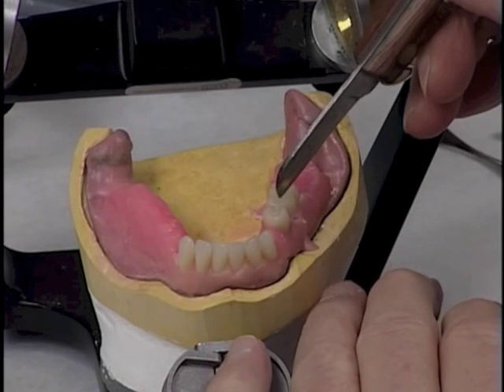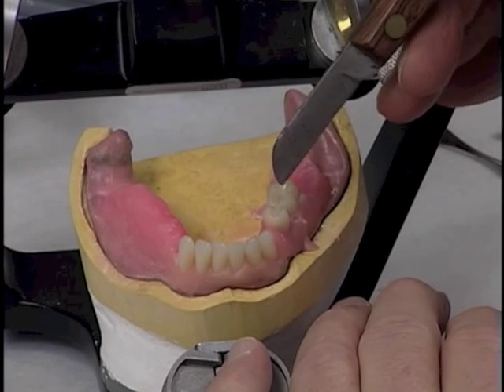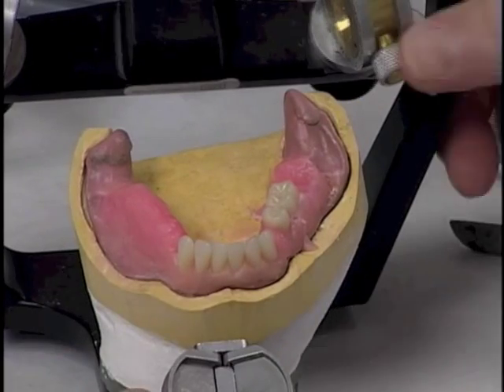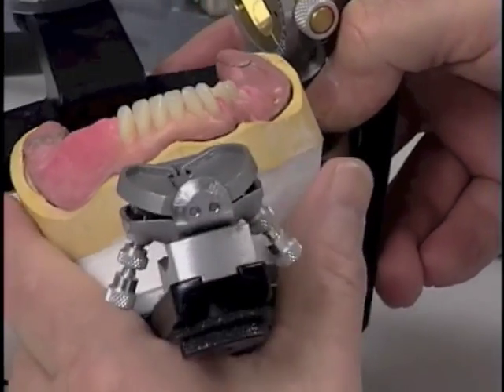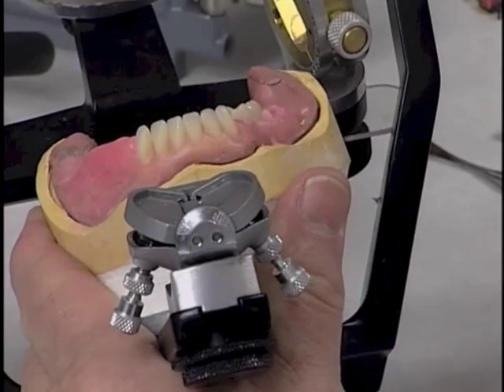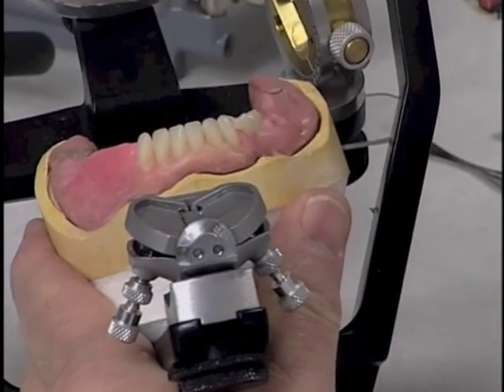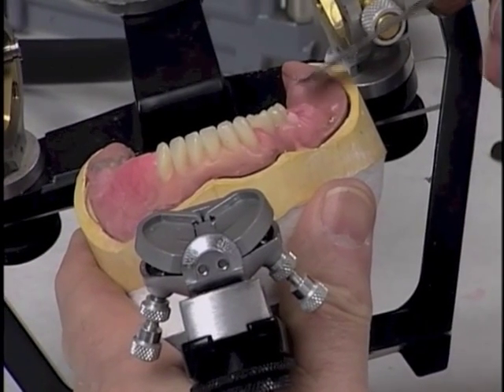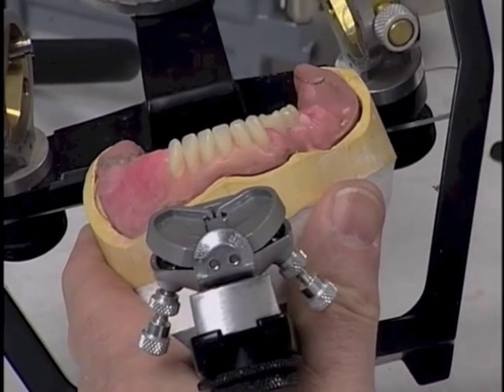We want to make sure that this marginal ridge is level with the distal marginal ridge of the second premolar, and at this point it is. At the same time that we're doing this, we want to analyze our occlusal plane, in that we would like that occlusal plane to end up somewhere about halfway or 2/3 of the way up the retromolar pad. So that appears as though that's in pretty good shape.